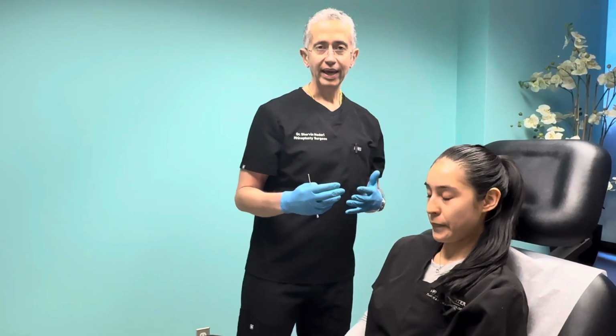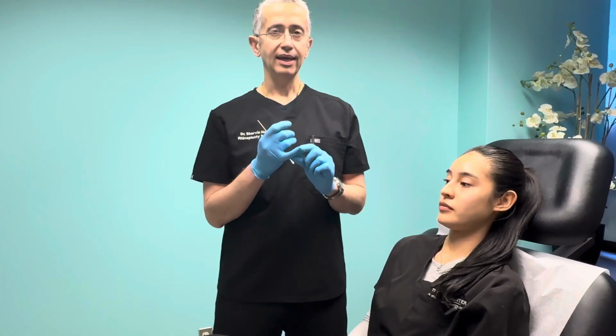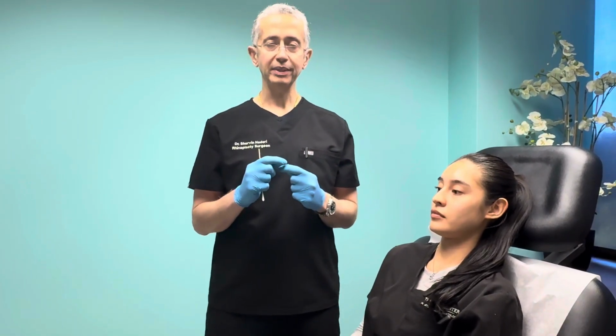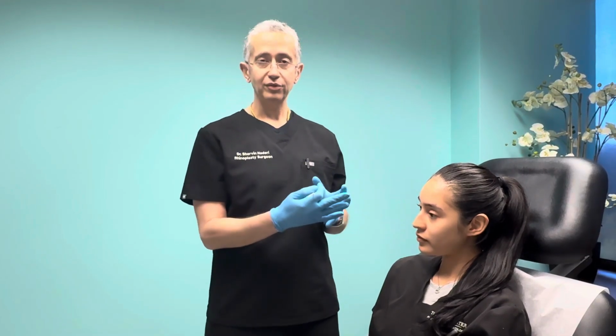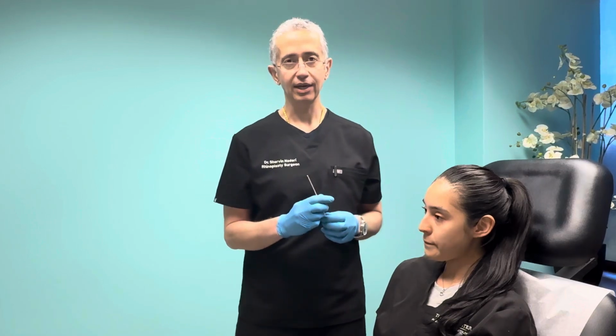We have stepped away from tear trough injections in people with extremely thin skin and people that don't have much of a fat pad. Those patients, over 20 years of doing this, we have learned that they end up getting this Tyndall effect, this swollen look. So at those times, we say, listen, you either gotta do nano fat or you have to do PRF. Nano fat with Dr. Kulak, PRF with Dr. Snodgrass. But if you're an ideal candidate for tear trough injections, it still works really nicely. So check out the technique.